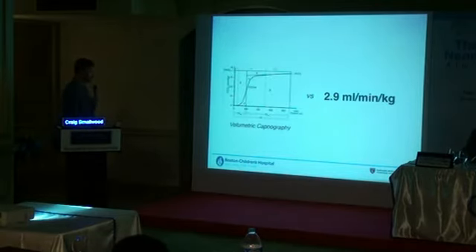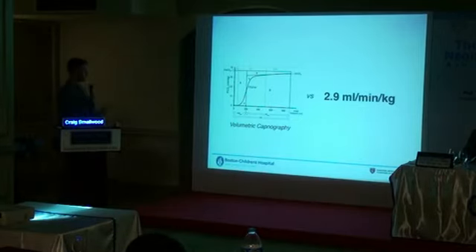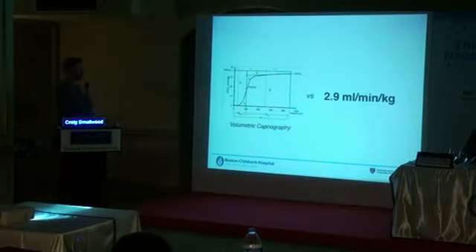Another thing that you can do with volumetric capnography, if you read any of the literature or look at some of the lectures that I have on Open Pediatrics, is that people will talk about interpretation of the volumetric capnogram. It looks very similar to time-based capnography, but it is distinct, for a couple of reasons. You can find out some really interesting things. So we begin to exhale. We go here. This is airway dead space. You can see that's labeled. At some point, we transition. We've amassed enough concentration of CO2 to call it alveolar gas.